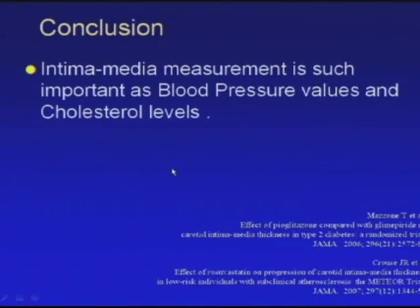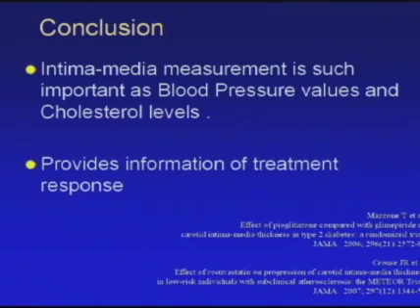In conclusion, Intima-media measurement is important, along with blood pressure values and cholesterol levels, in order to estimate clinical and subclinical atherosclerosis. And the Intima-media measurement provides information of treatment response, for example, when the patient is undergoing treatment with statins.